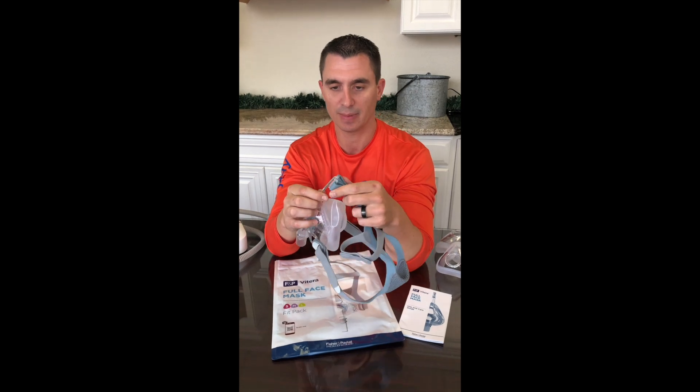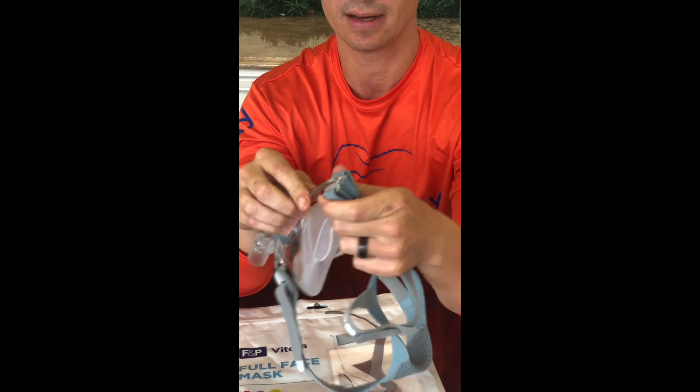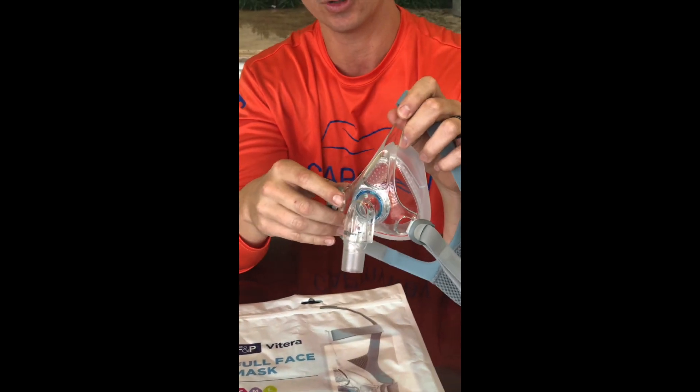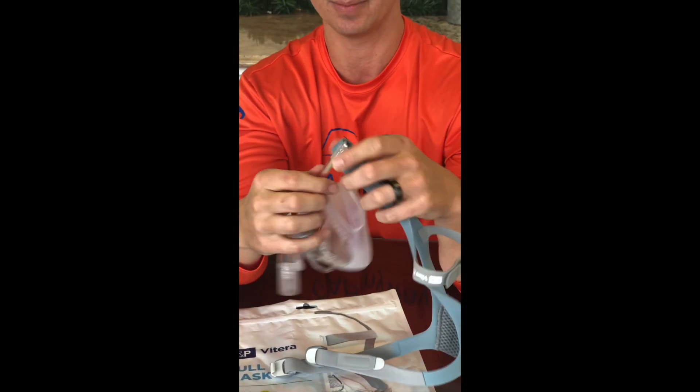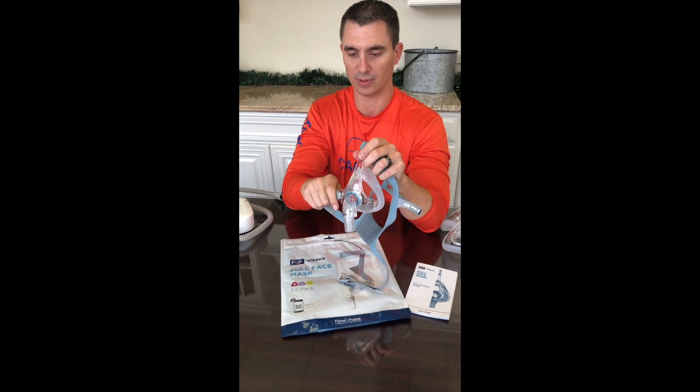Another really cool feature is how quickly you can disconnect the headgear. There's a little clip that pops in and out of the top of the frame. So really within seconds, if you're going to maintain your headgear, you can take the entire thing loose and reassemble it just as fast when you're ready to use the mask.